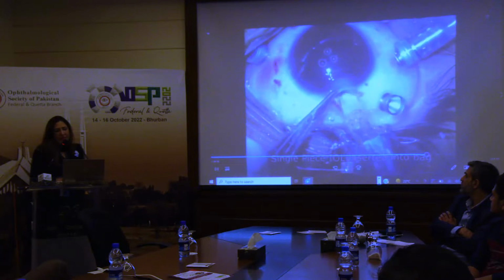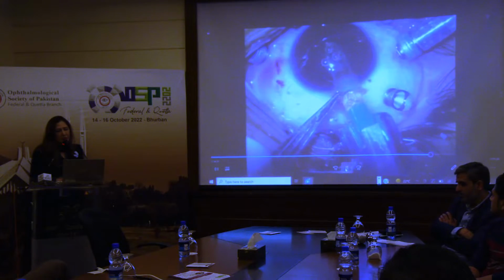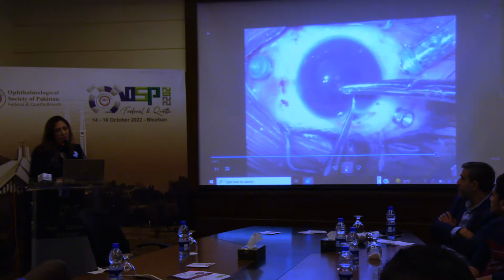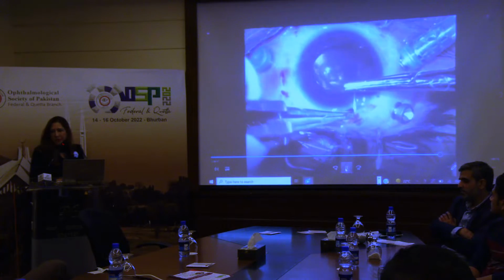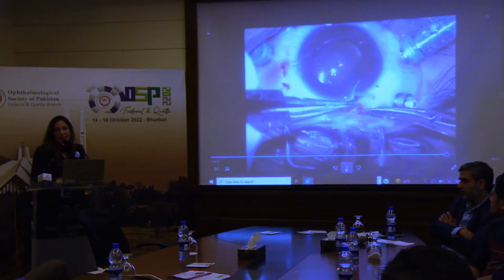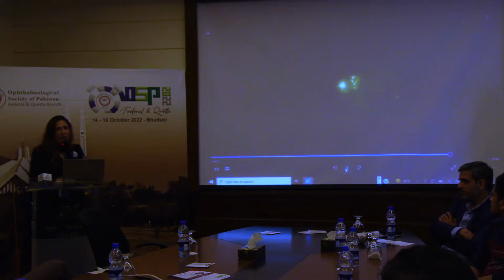After that, I used the bag and put a single piece intraocular lens, because a very small radio frequency posterior capsulotomy was done. Once the foreign body was out, the multi-piece intraocular lens is available in the hospital, and we didn't get anything from the patients. In our hospital we provide everything, which is a blessing in disguise. Vitrectomy is happening, everything is happening, and you don't charge them. They come with the 10 rupee admission slip only.